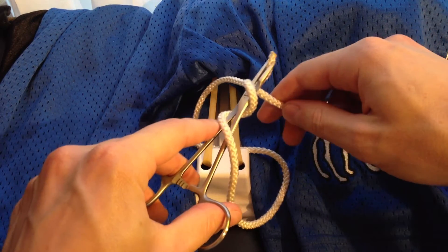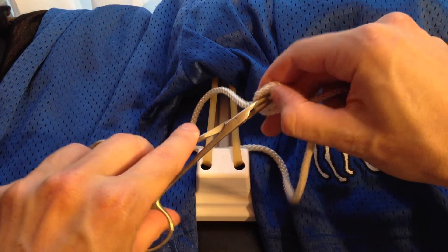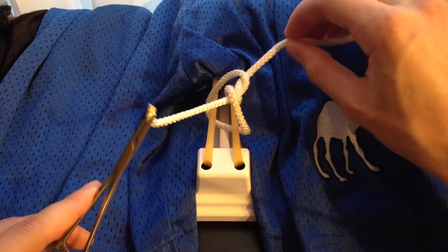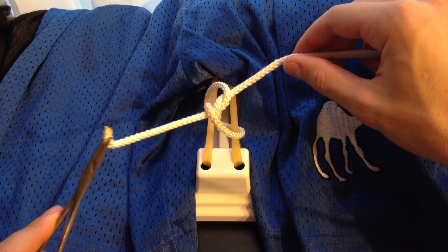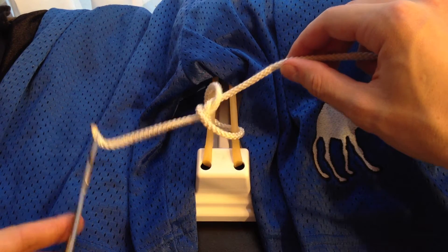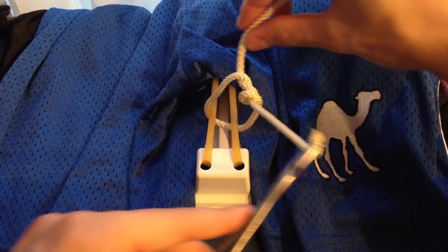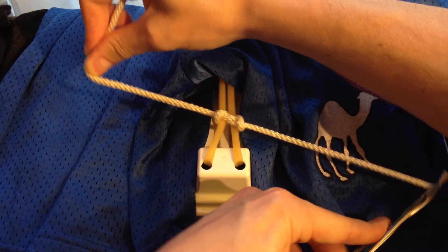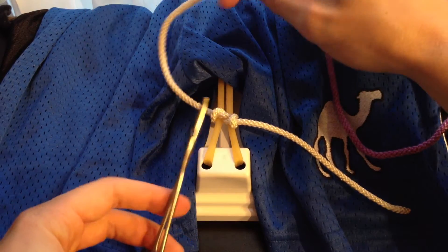I'm using thick strings so you can see what's going on, so I'm just going to work this through with my fingers. And there we go — we've got our first overhand knot. When we pull this tight, you always pull the short end to the opposite direction from where you picked it up. I grabbed it on the left, so to pull it tight, I'm going to cross my hands and pull it to the right side. And there's our first knot.